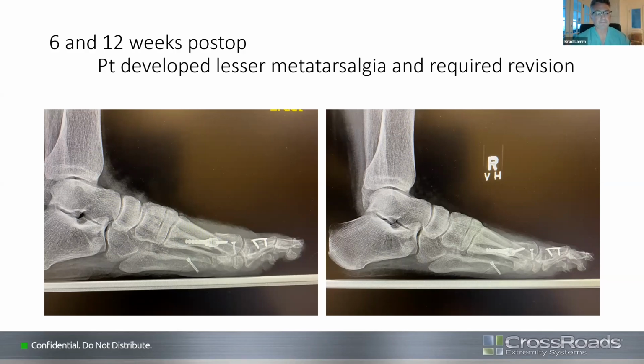Yeah, I would say that definitely the younger patients with the more severe IM angles, I would do a DynaBunion, because I'm worried, like Evan said, that you could get recurrence pretty quick. So I want to make sure it's a lifelong fix. Some other concerns are, like Evan said, if the MP joint is not reducible, you're going to have a tougher time with a minimally invasive approach to get that MPJ back in position, as Evan alluded to in one of his cases. So if it's non-reducible, then I may have to do more than just the typical technique for mini-bunion.